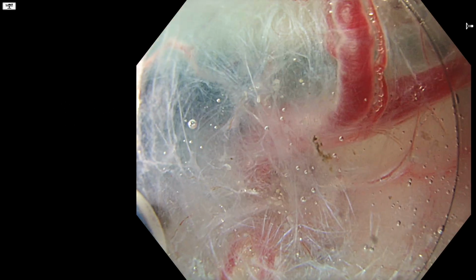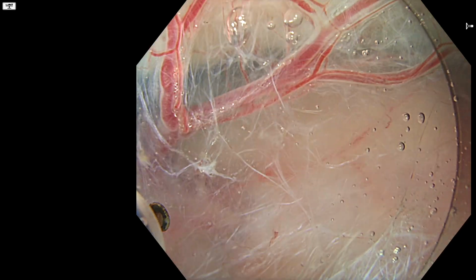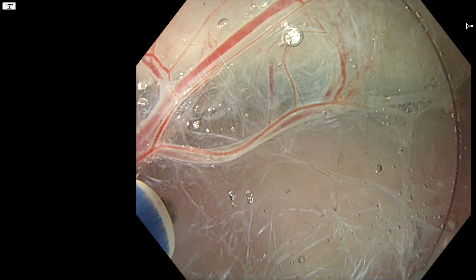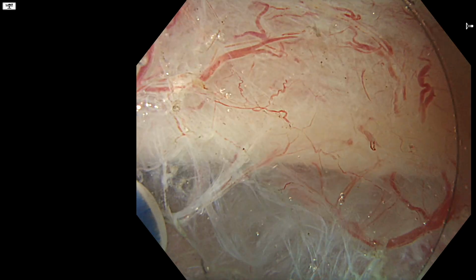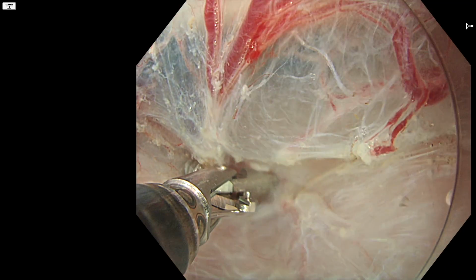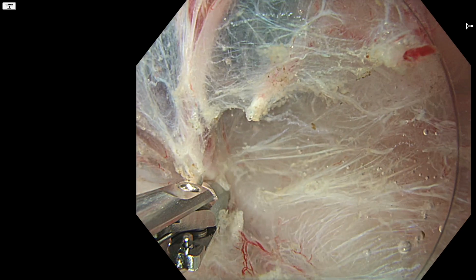The technique starts identically to standard ESD. We create the initial mucosal incision and then begin submucosal dissection, carefully coagulating vessels as we go to keep the field clean and maintain optimal visibility.